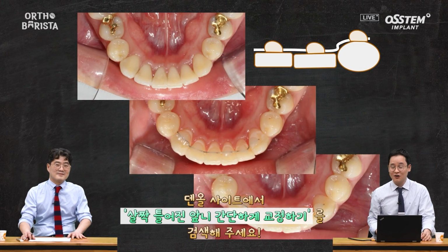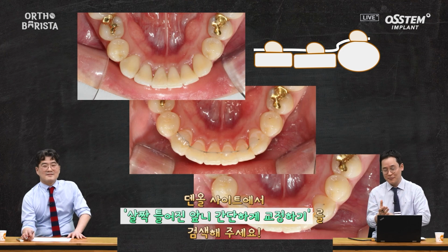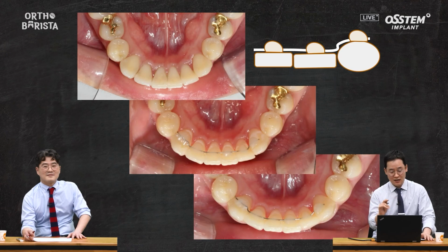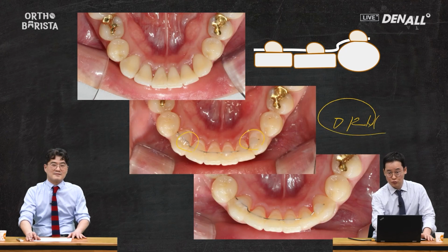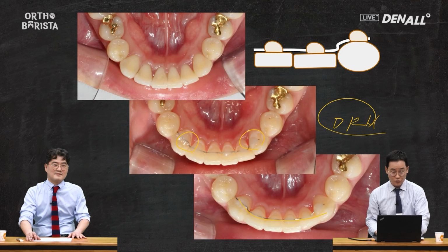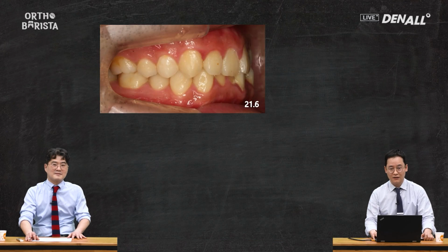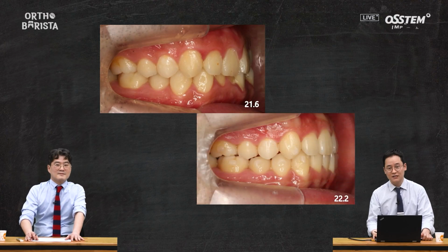Here, I'm sharing a clinical tip. Even in clear aligner treatments, for those particularly stubborn teeth that refuse to move, there are various approaches, but this method involves a thin nickel titanium wire. Specifically, this is a 0.016 nickel titanium wire, which allows for adjustments. This wire can be permanently bent into shape, right? And later, this wire can also be used as a retainer. For more details, I recommend watching the referenced video. It will provide helpful insights. Now, regarding vertical adjustment, it often works very well, but there are cases where it doesn't.